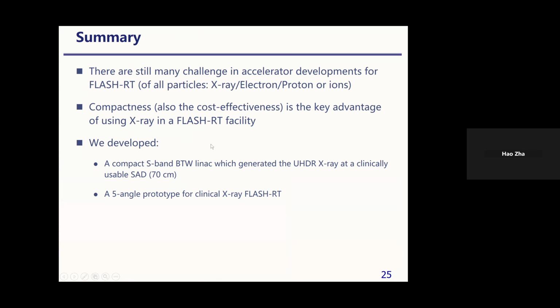Okay, so let's conclude. There are still many challenges in accelerator development for flash radiotherapy. No matter what kind of particle we choose, X-rays, electrons, protons, or ions, there are dedicated challenges for each modality.